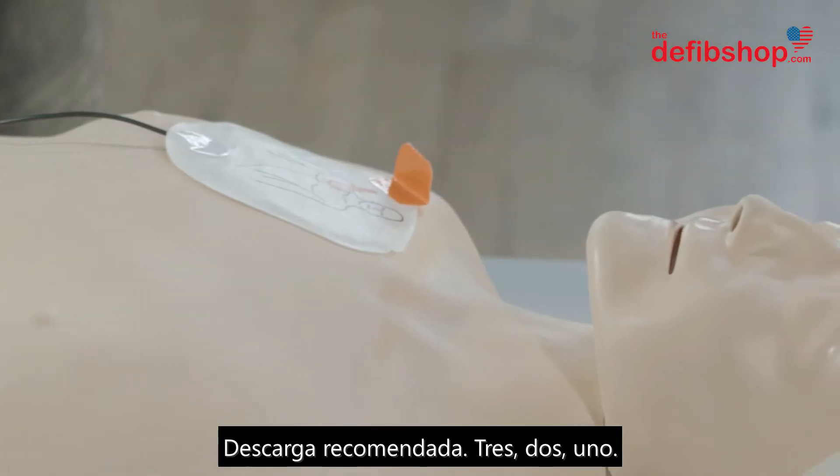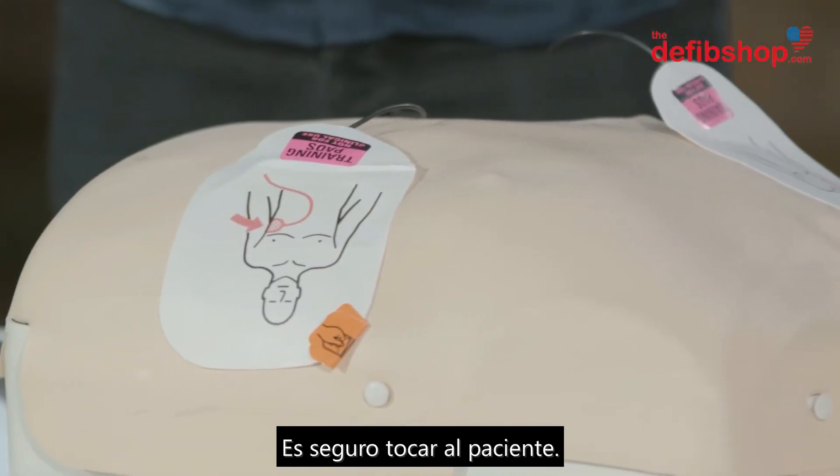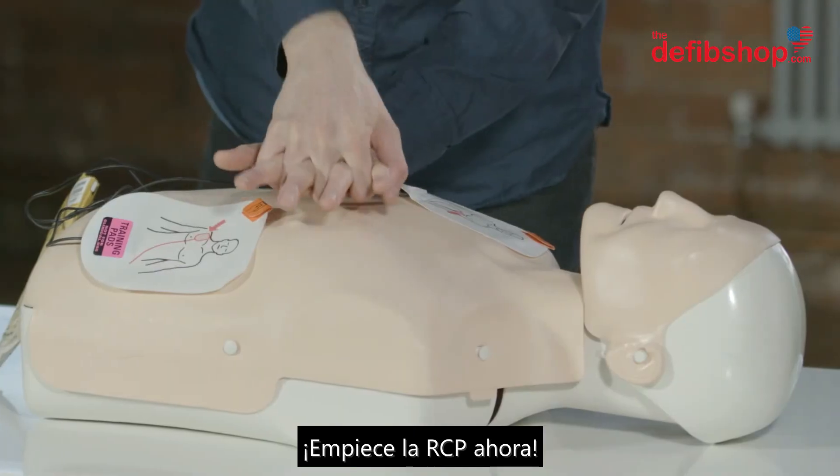Stand clear. Shock advised. Three, two, one. Shock one delivered. It is safe to touch the patient. Begin CPR now.